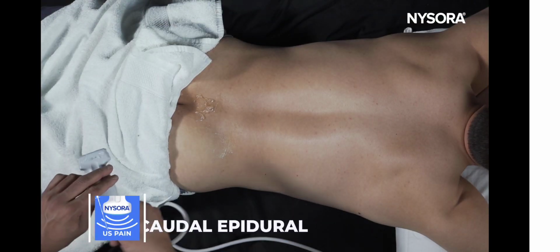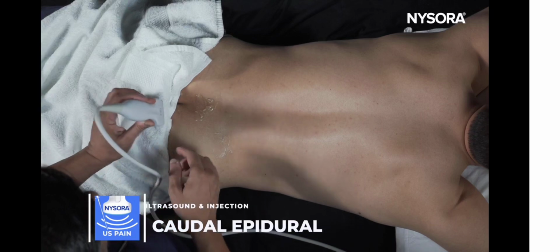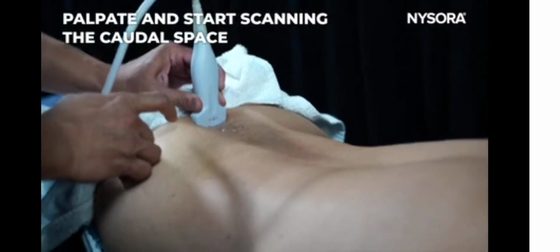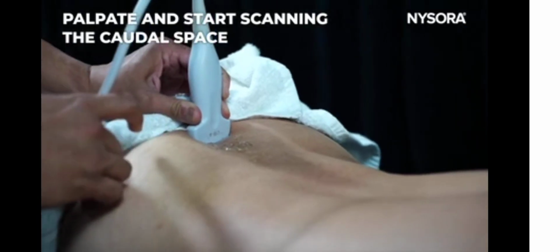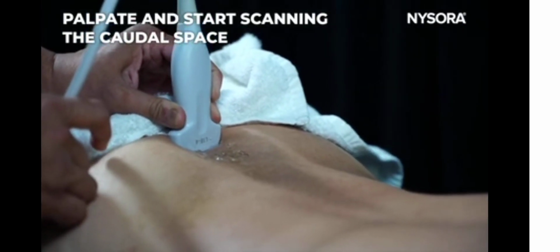I'm going to show you how to scan for the caudal epidural using ultrasound. You could palpate for the caudal space and then put the ultrasound probe on top of the caudal space. That's another good way to actually get to the structure quickly.